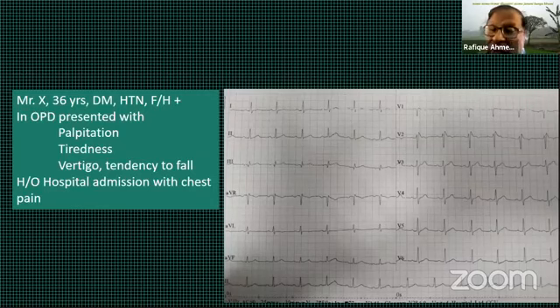So please continue. Those are the things when you interpret, Hafiz mentioned the clinical scenario. Second, look at lead V2, the duration is wide, but in other leads, it doesn't look wide. That means that wideness is probably not from the QRS. It's probably from the ST segment.